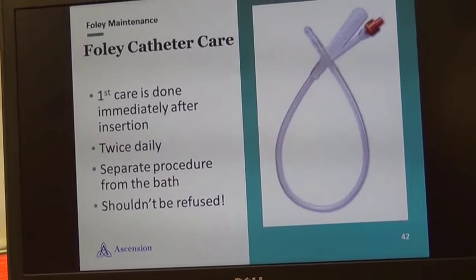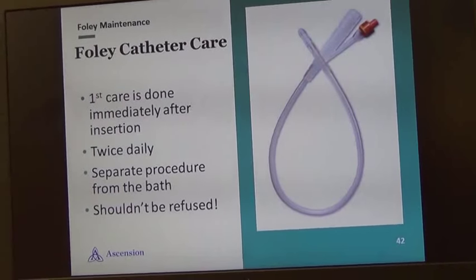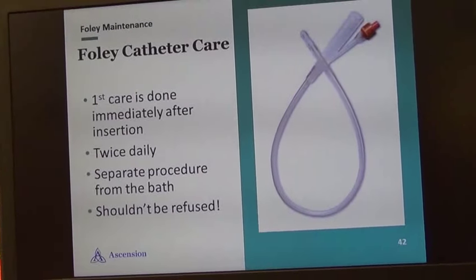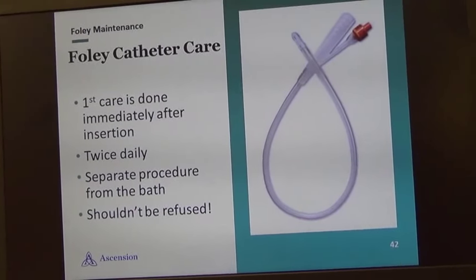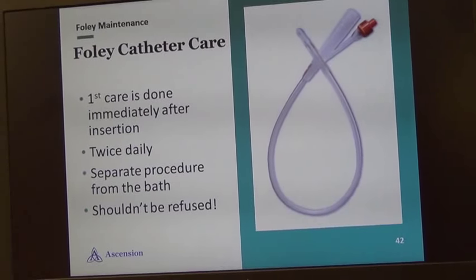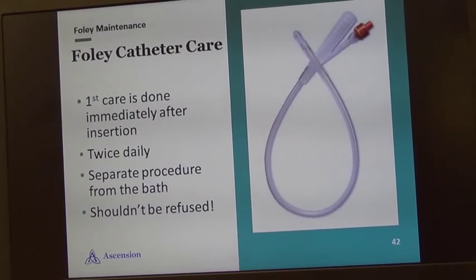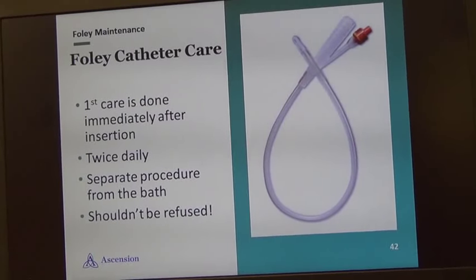At this time, we will move right into catheter maintenance care because immediately after insertion is when your first Foley care should be completed. For Legacy Affinity hospitals, Foley care should be completed twice daily and as a separate procedure from the bath. Refusal of Foley care should be highly discouraged. Please consult the physician or management if a patient is refusing Foley care.